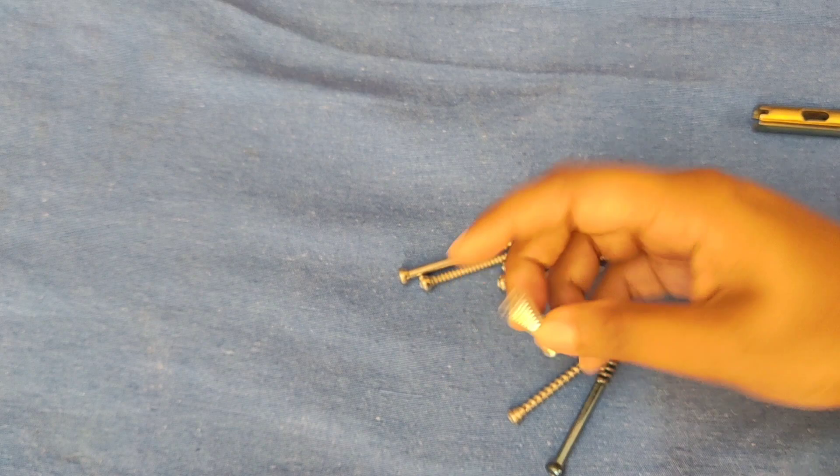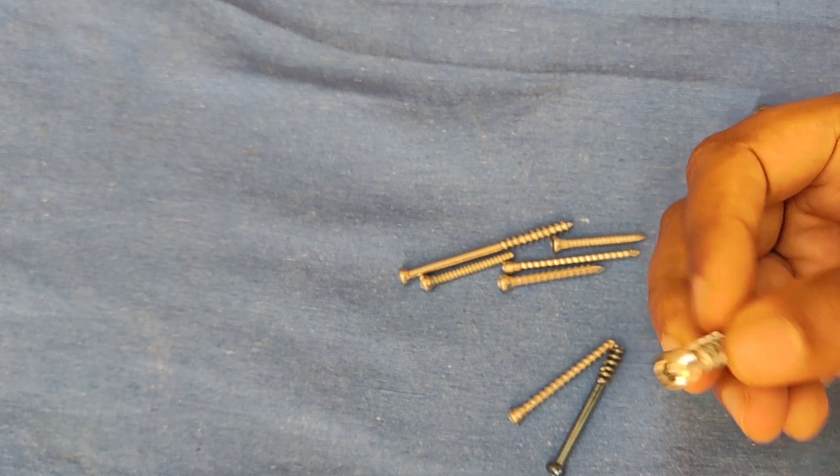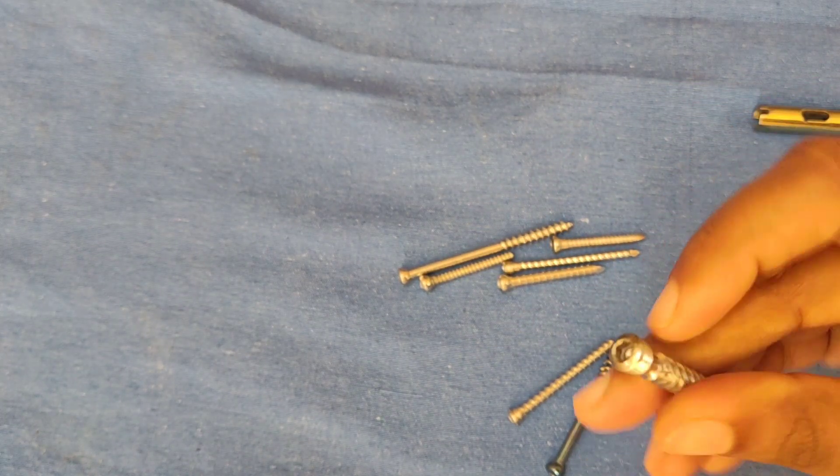Parts of a screw: head, shaft, thread, and tip.